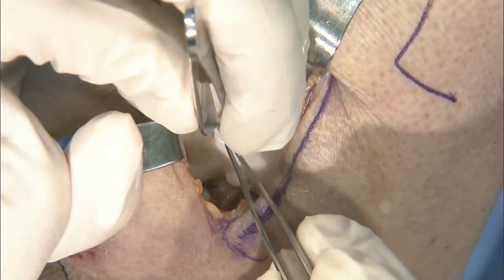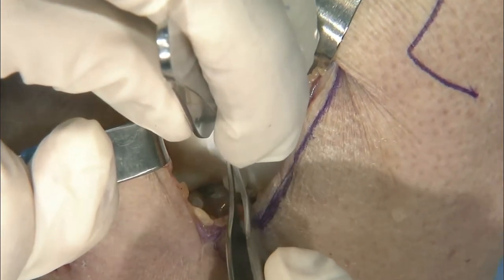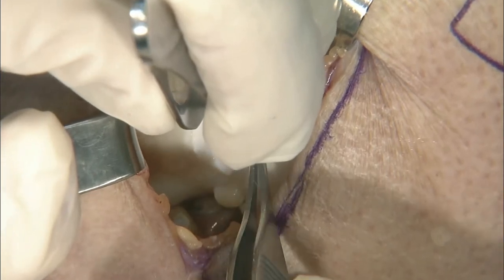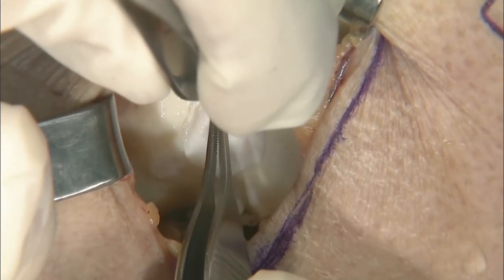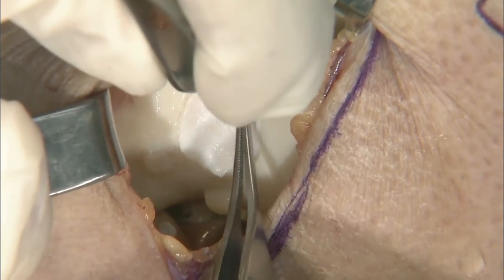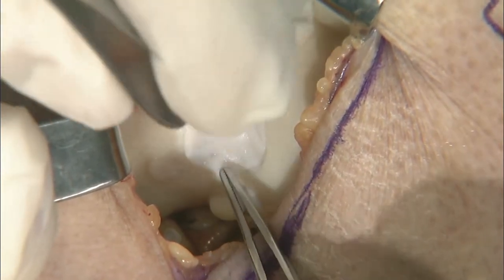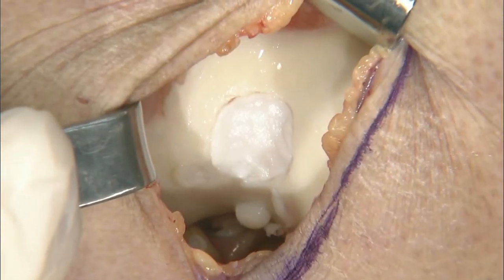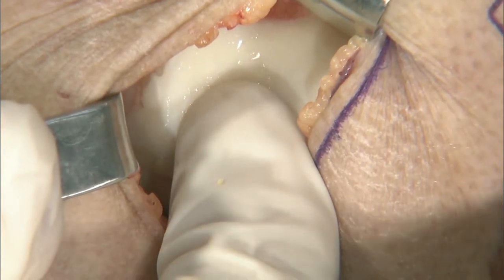And basically now I'm coming into the defect. And I'm right in there, and I'm below the surfaces of the joint there. Below here, below there. I'm really kind of getting the air bubbles out of it. I'm getting it down into the defect. And then once I have a pretty good placement of it, I'll take my thumb and just gently push it in there once or twice.